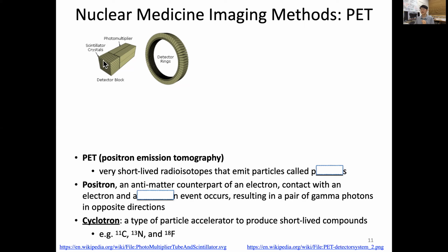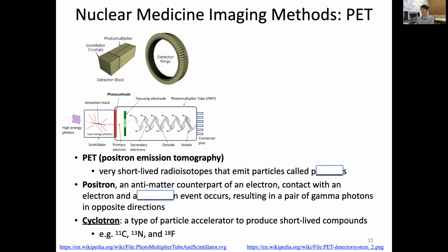So this one unit of PMT and scintillator is a detector block. And for the principle of PET, we do need many of these detector blocks circling the subject. You can see here, not only one rim, but it could be multiple rims to detect a 3-dimensional structure. And you can imagine it costs a lot, because there are many PMTs, which are very costly.